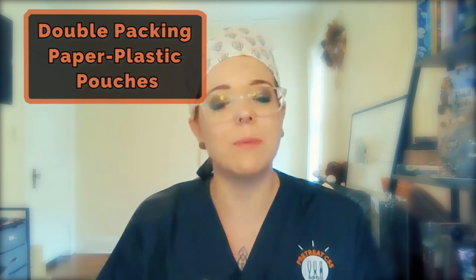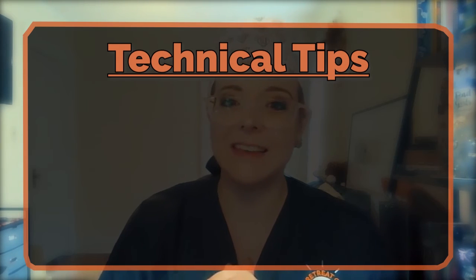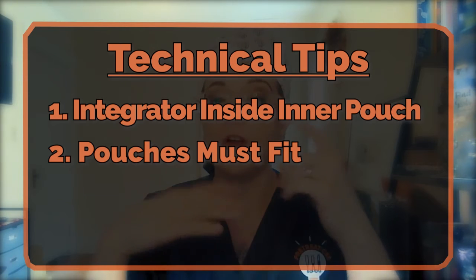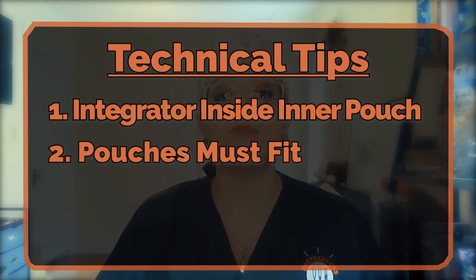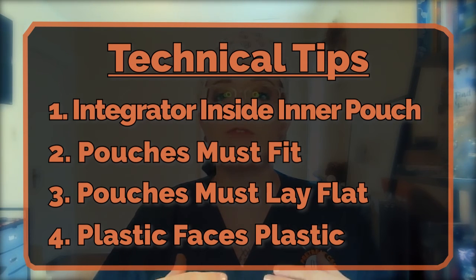So we went over our checklist, got the basic technique down for peel pouching, and even went over a couple of ways to seal open-ended pouches. Let's dive into another technique: double packing paper-plastic pouches. Whether or not this technique is used is determined by your healthcare facility, but it should only be performed if the pouch manufacturer has validated the product for this use. Quick rules: integrator goes inside the innermost peel pouch only; the pouches have to fit inside each other — no folding, cramming, or wrinkling allowed; the inside pouch must lay flat; and the pouches should be positioned so that plastic faces plastic. This allows for complete sterility throughout the entire pouch.